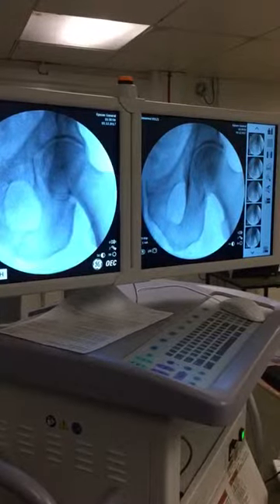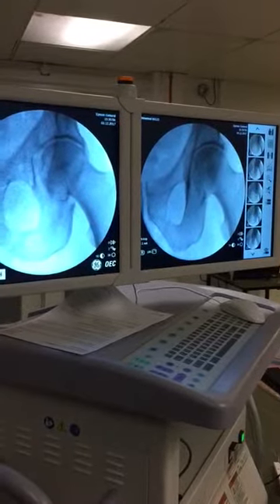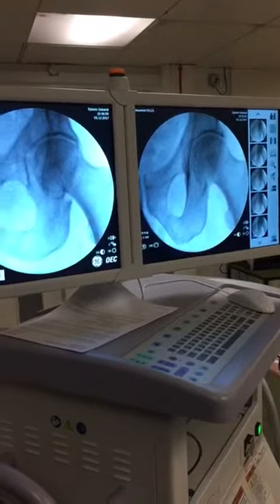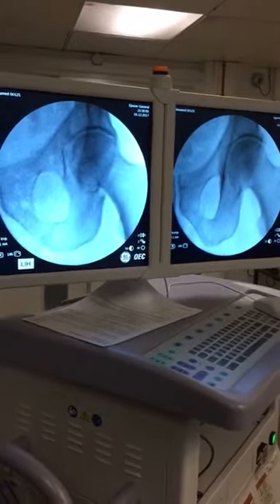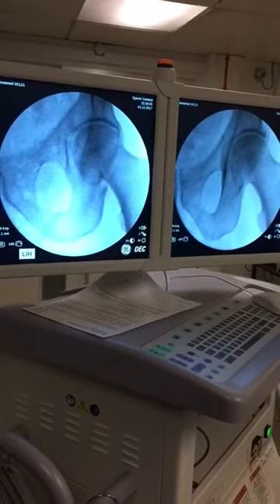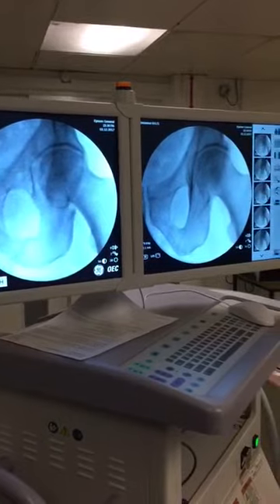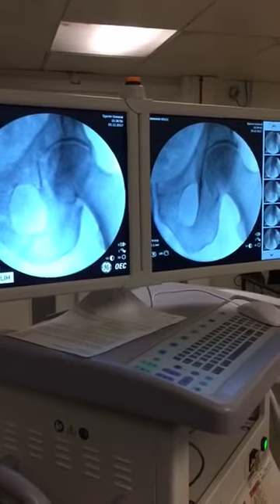Femoral articular branches, which are going to be there as a radiological target on the top of your acetabulum, in that area where my laser is pointing. And you will have the obturator branches, which are going to be at the lateral edge of the teardrop. Now, teardrop is actually a radiological finding, it's not an anatomical finding.